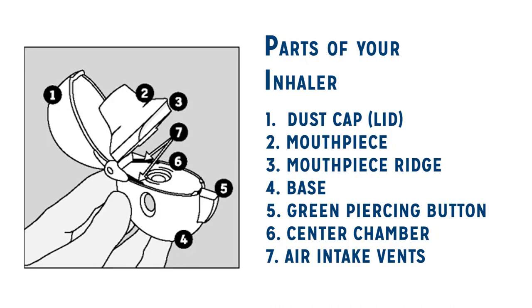To use this device, you will need to know the parts of the inhaler: dust cap, mouthpiece, mouthpiece ridge, base, green piercing button, center chamber, air intake vents.